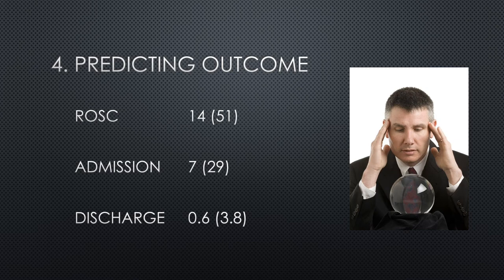You know, it may be reasonable to continue a couple of cycles of CPR, check if you can find anything reversible on ultrasound or on your venous blood gas. And if you don't find anything and she remains in arrest, you know, within a few minutes, it would be reasonable to stop. But I think the main point is use the presence or absence of cardiac activity to factor in with everything else to make a reasonable judgment about any meaningful chance of recovery and base your decisions on that.